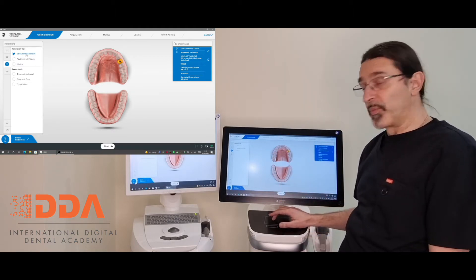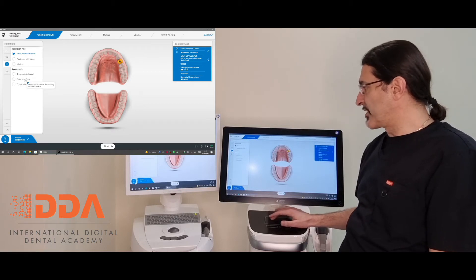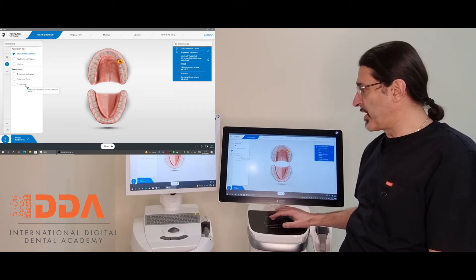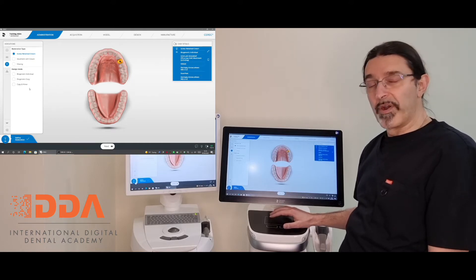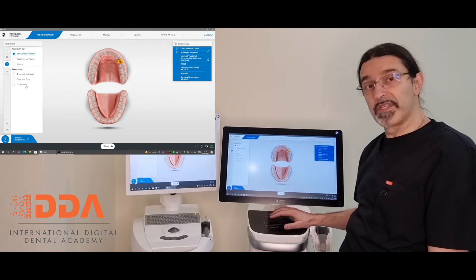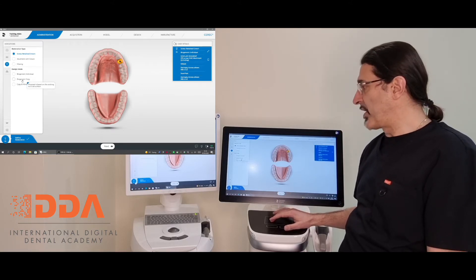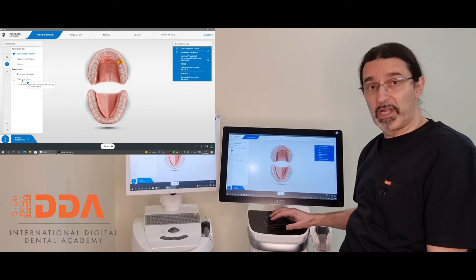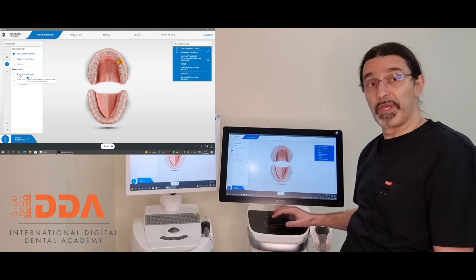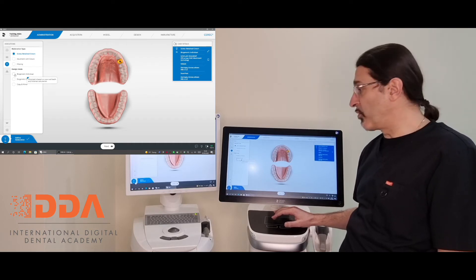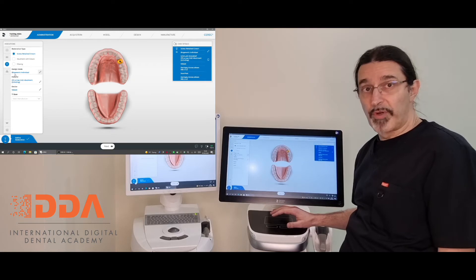So the first thing we'll do is select a screw-retained crown. Once you've selected it, we've got the options of a biogeneric individual, a biogeneric copy, or a copy and mirror. If you want to copy one of the other teeth anatomically and mirror it, you can choose that third option. Or biogeneric copy where you can draw the outline of a previous temporary tooth and copy it into the permanent. But personally, I always like to choose the biogeneric individual as this gives me the most options for modifying the crown.